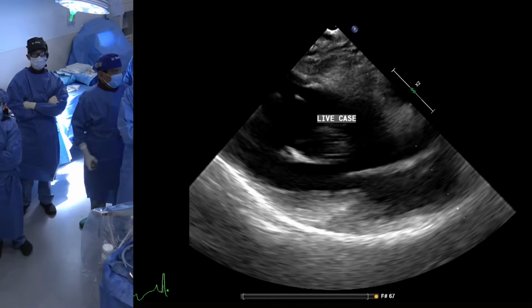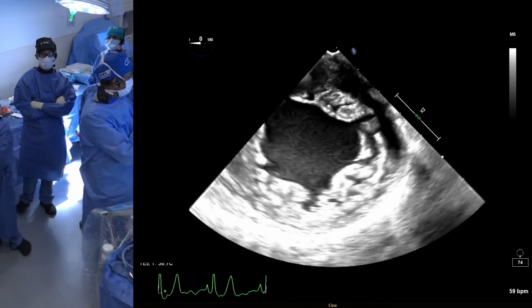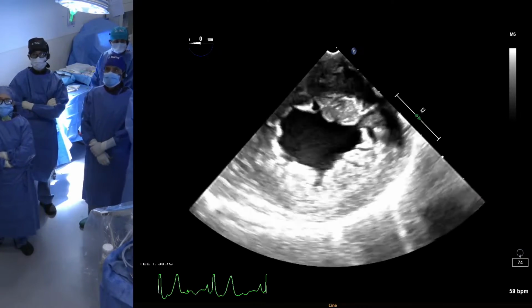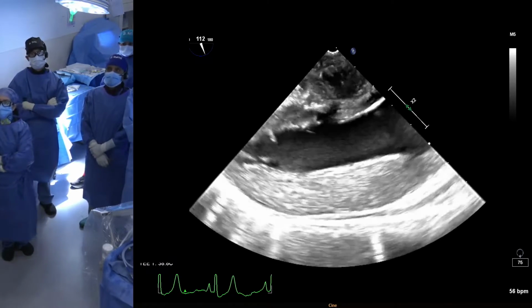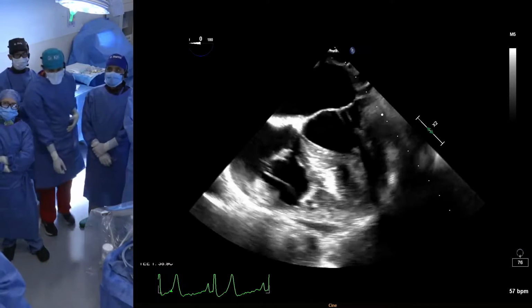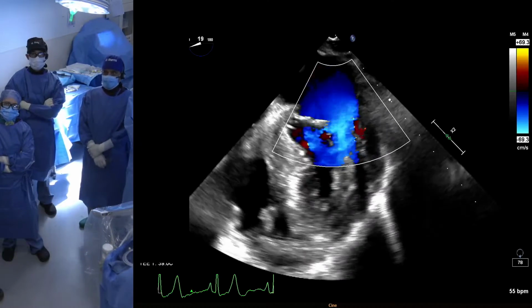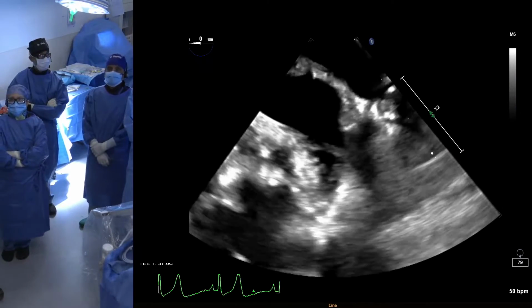Good morning. Thank you, Dr. Sharma. Good morning from New York. I have with me Dr. Fortis, our imaging structural fellow, and Hafizur, a great sonographer. As you can see here, this is deep gastric, normal LV function, no pericardial effusion. Another view, long axis of the ventricle, looks thickened with normal function. These are the mid-esophageal views: normal LV function, normal RV function, minimal to mild tricuspid regurgitation, minimal to mild mitral regurgitation, left atrial appendage clean.